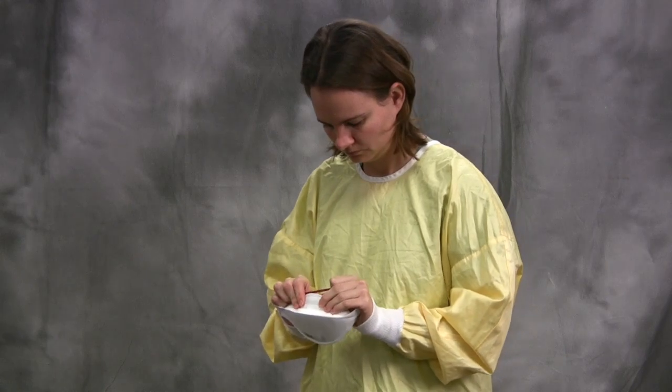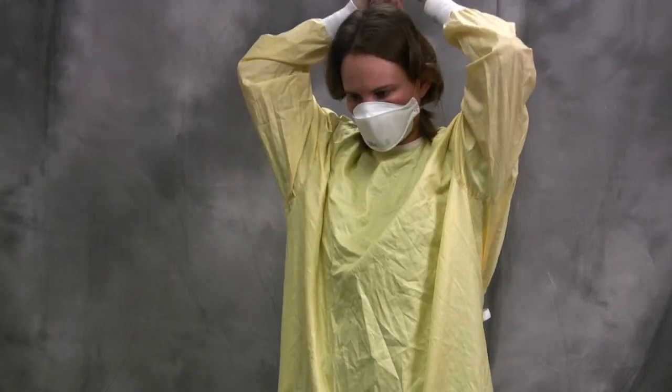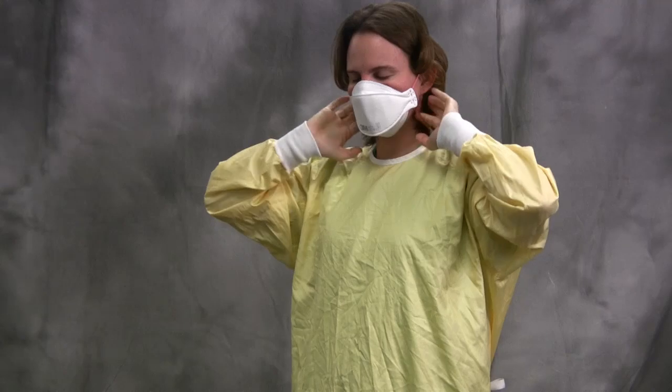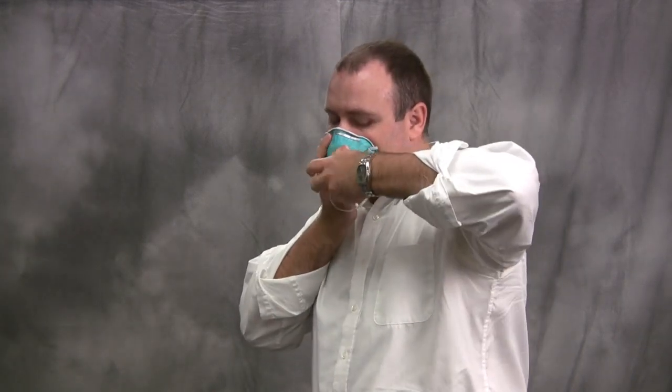Respirators can be shaped to fit the face or be folded. Folded respirators are applied in a similar fashion, ensuring that the respirator is fully unfolded and has a tight seal with the skin. Breathe deeply in and out, feeling for any areas where air may be escaping along the edges. Facial hair will prevent the respirator from making a tight seal with the skin — even a small amount of stubble will compromise the seal and reduce the protection provided by a respirator.